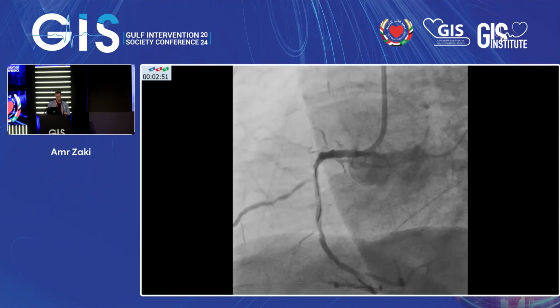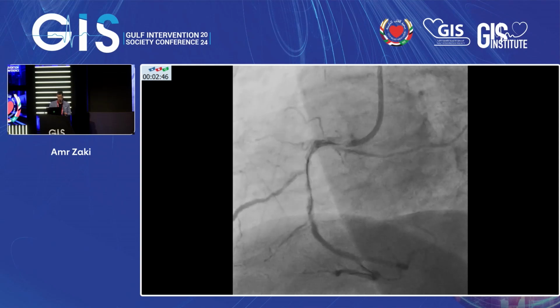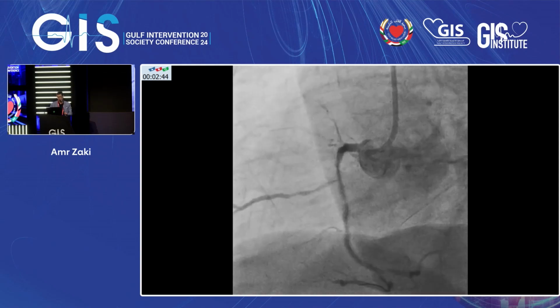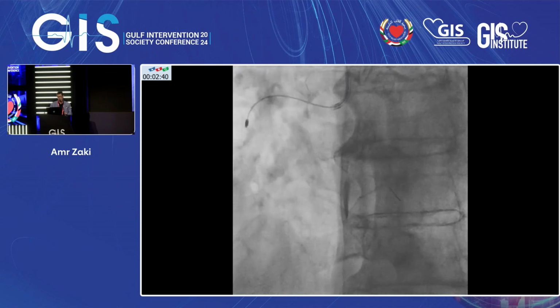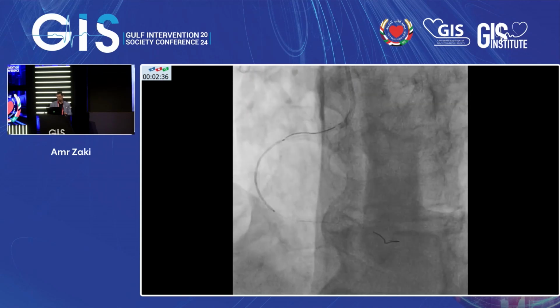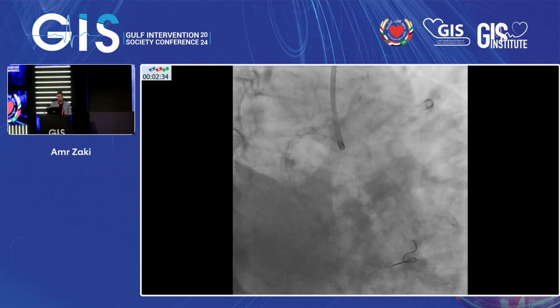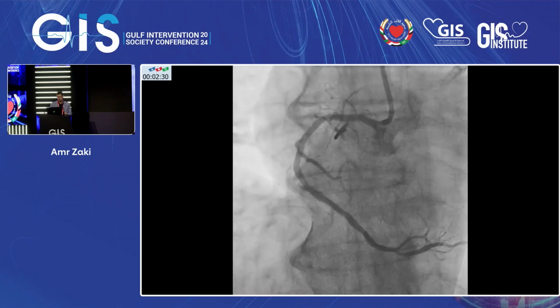The left main here is not so tight, so we deferred it. This is the right coronary, also heavily calcified. Using the same burr, taking the same concept in the one session with rotablation, and then the same concept, taking the balloon, and this is the final result.